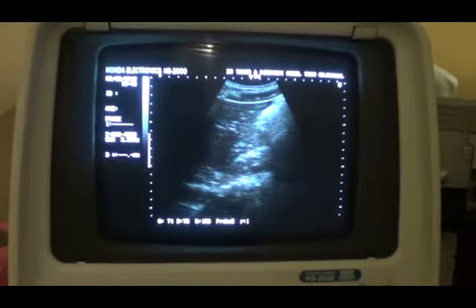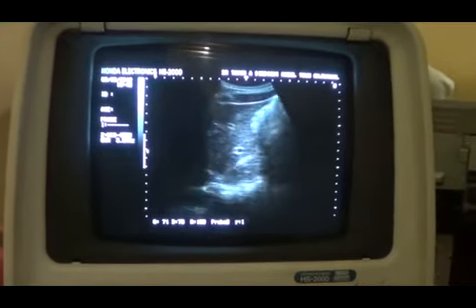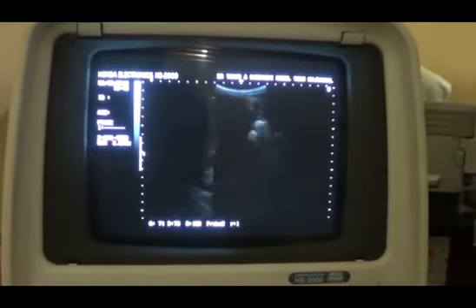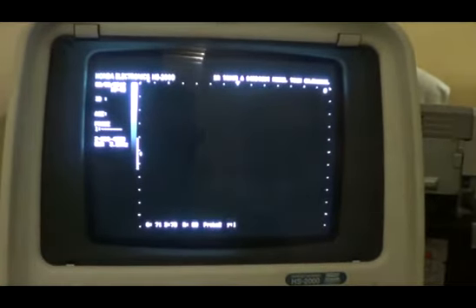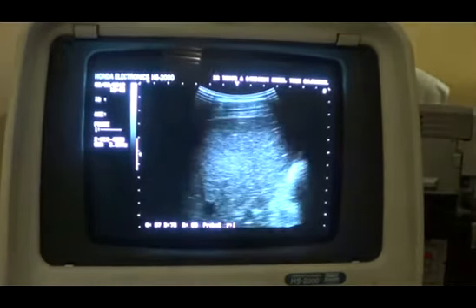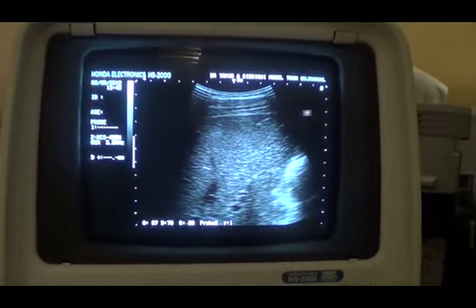Well, this is the ligamentum venosum, this is the IVC, this is the caudate lobe, segment 1. The outer surface of the liver is smooth, regular. Here you can see this is the outer surface of the liver.